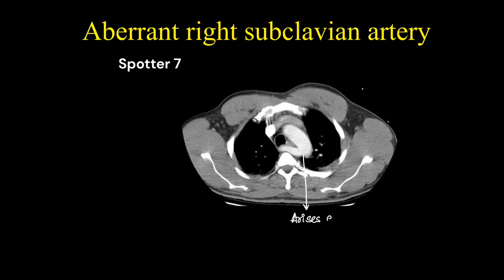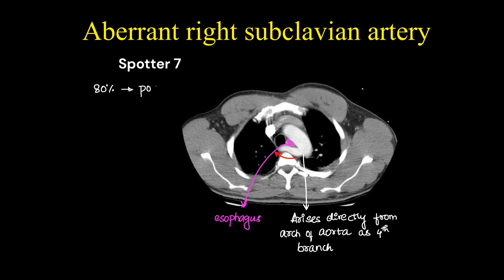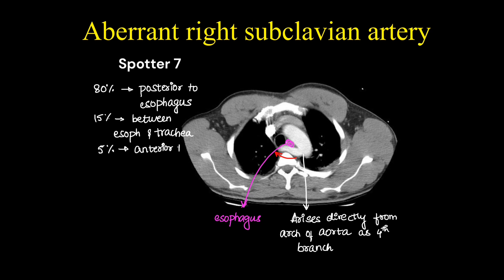This is a case of aberrant right subclavian artery. The right subclavian artery is arising directly as a branch of the arch of the aorta as a fourth branch and moving towards the right side. In our case, it is moving posterior to the esophagus. In 80% of cases it is posterior to the esophagus, 15% between the esophagus and trachea, and in 5% of cases it can go anterior to the trachea.